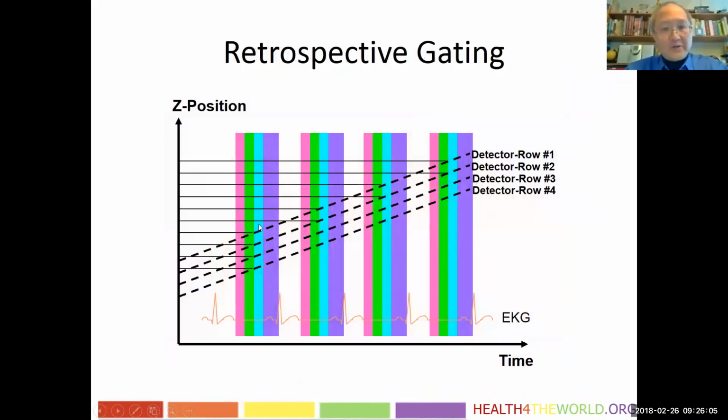Most of the time in cardiac CT applications, we will use what we call retrospective gating mode. We will have a very low pitch progression of the scanner. I plot here a graph where the x-axis is time and the y-axis is the table position. These dotted lines trace out, for an example of 4 detector slices, how it progresses in space as they go over in time. Now, let's suppose that you want to acquire certain data from a slice position from here to over there.